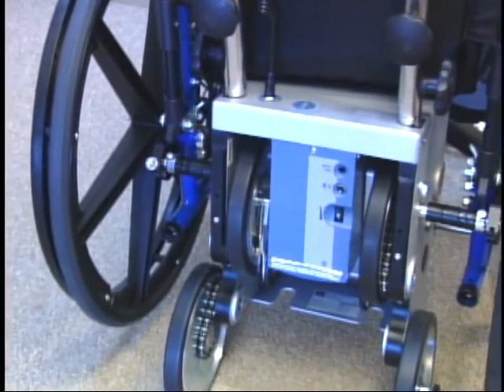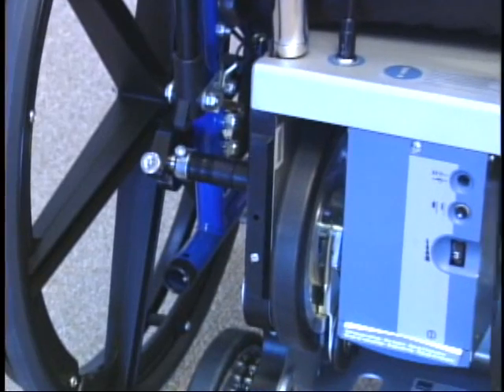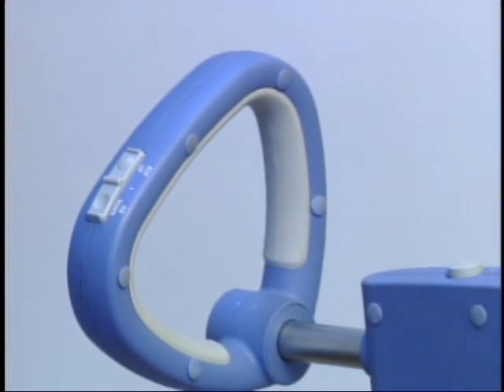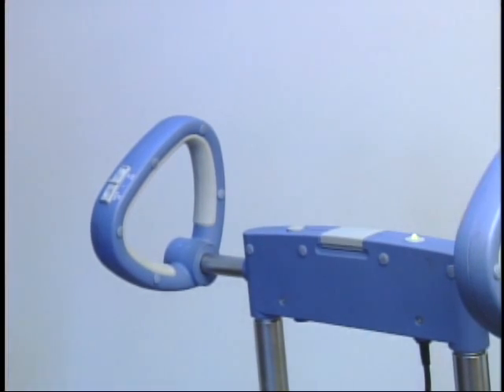The wheelchair user may remain seated while attaching the Scattermobile; no transferring is necessary. The controls of the Scattermobile are on the handlebars. The up and down rocker switch is located on the right handle. A green light indicates it is operational when the power button is pressed.